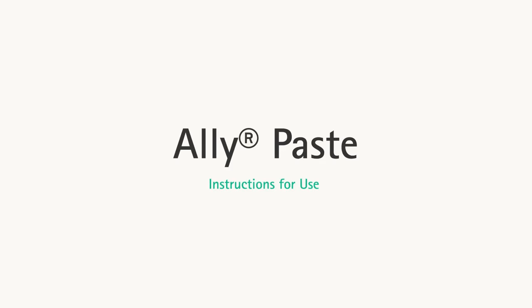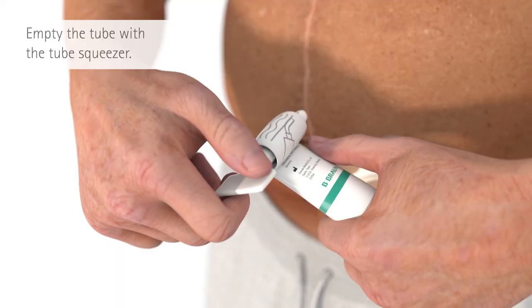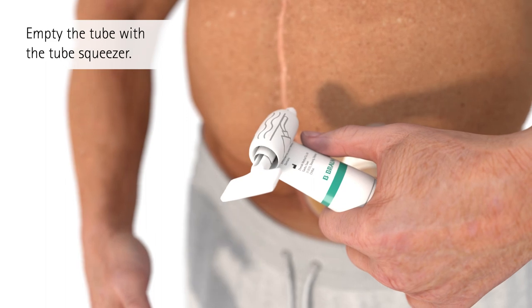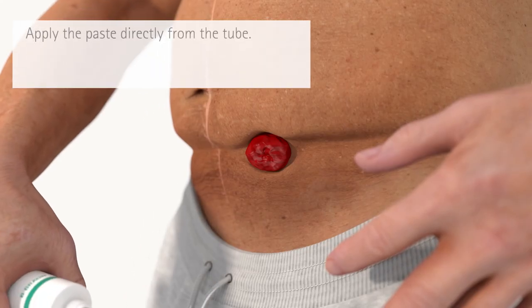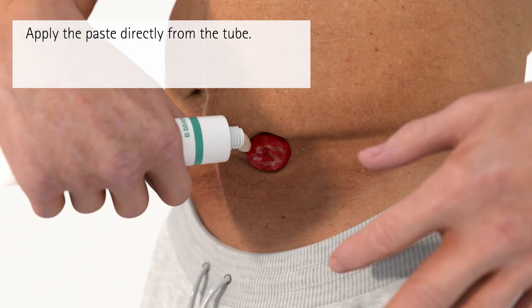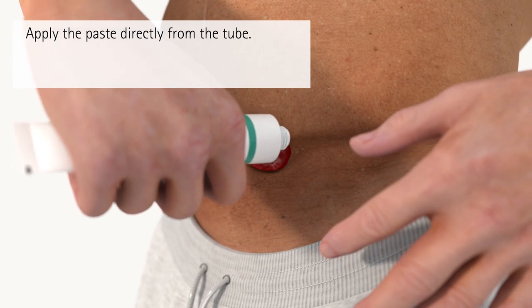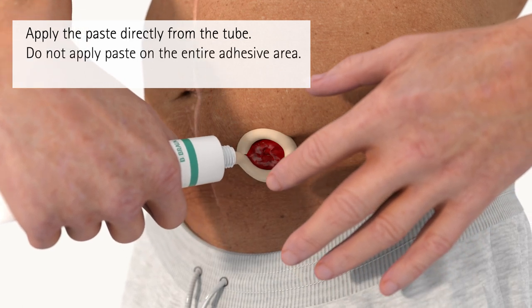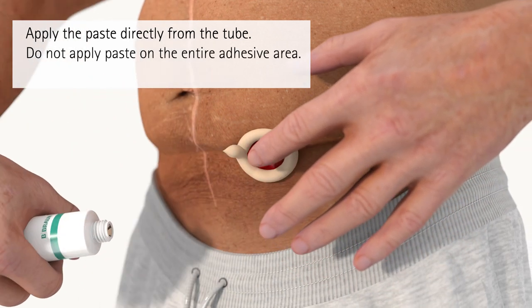Apply paste. If needed, use the tube squeezer to easily empty the tube. Apply the paste directly from the tube onto the skin. It can also be applied directly onto the wafer. Do not apply paste on the entire adhesive area.